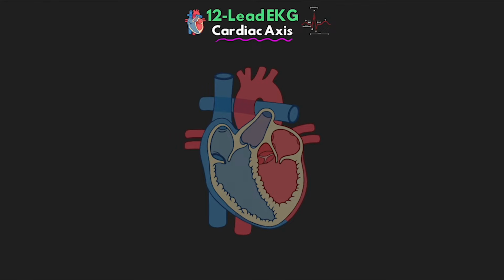Alright, now let's talk about the cardiac axis and really what this means. Remember that when our heart depolarizes, we have electrical activity that's taking place going in all sorts of different directions. So there's really millions of cardiac myocytes all facing in all sorts of directions.